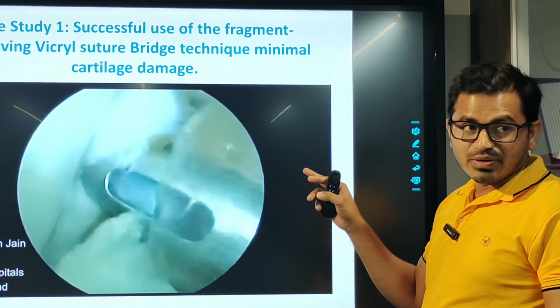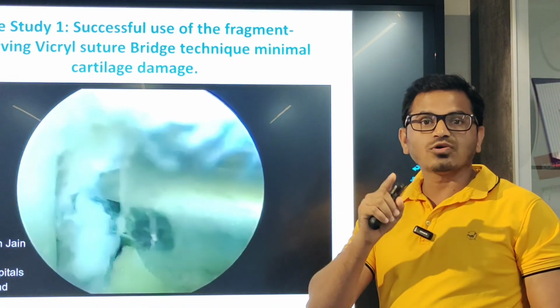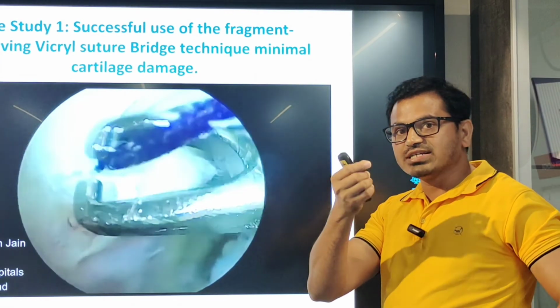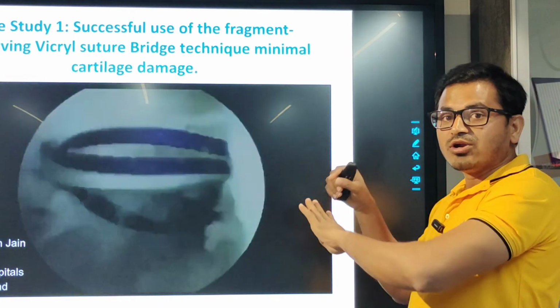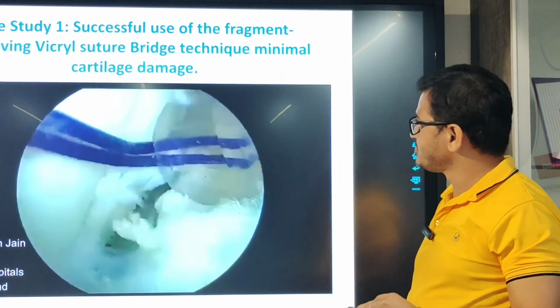In that 5.5 mm Osteocare anchor, we are using 3 to 4 strands of Vicryl suture. After reduction, we pull over these Vicryl strands in a fan-shaped fashion, and we will secure these strands with the knotless push-lock anchors on the other edge of the defect.